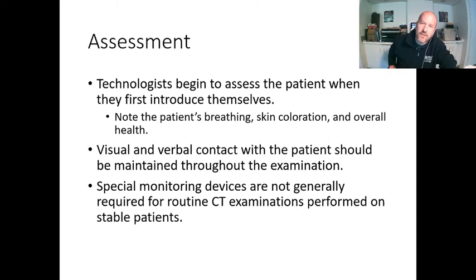Assessment. We're constantly assessing people, right? I always imagine I'm kind of like the guy at 7-Eleven or wherever, looking at the height marker for each person that walks through the door. But I'm not necessarily trying to size them up for criminal activity. I'm trying to size them up for how likely they are to croak in my exam room, right? So I am interested in their ethnicity, their age, their gender. All of those things are factors. I'm interested in their level of anxiety, right? All those things can influence just how successful they will be in getting the CT done in a way that's happy for everybody. So visual and verbal contact is going to be important.